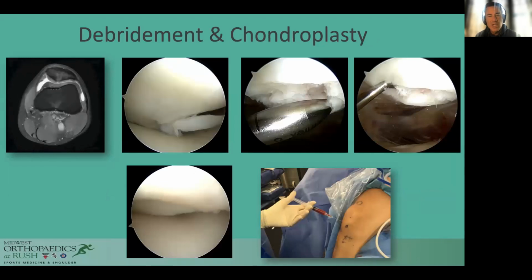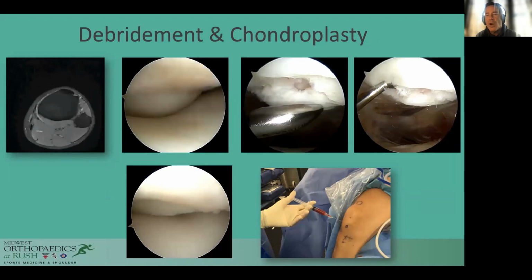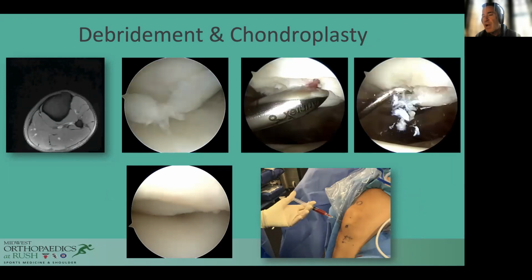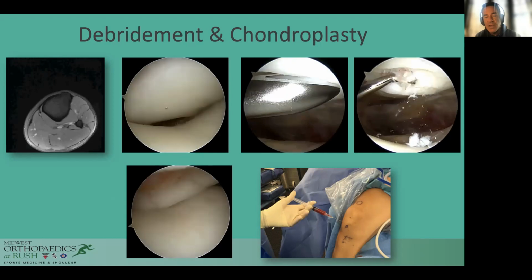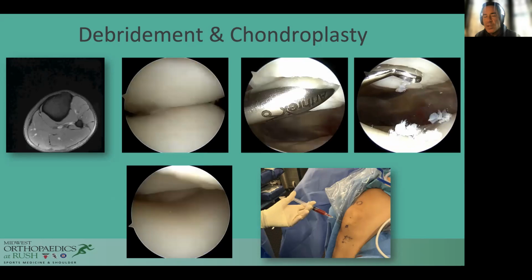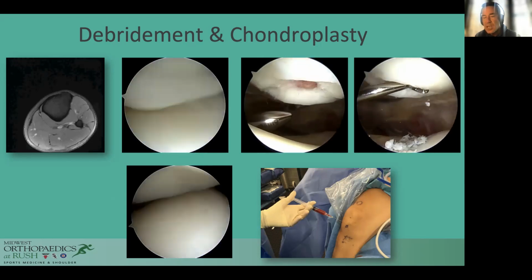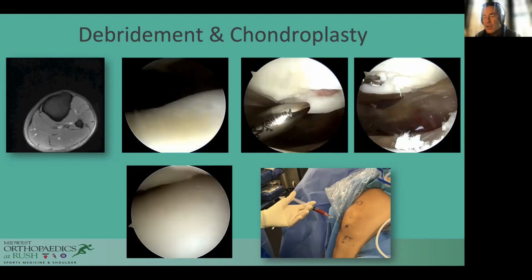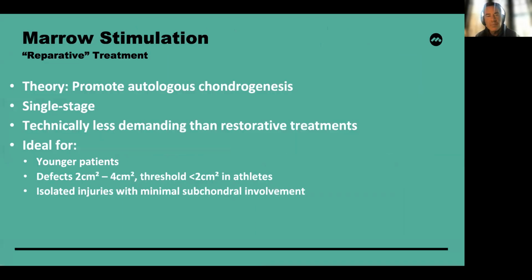Debridement and chondroplasty, as seen in this example here with a patella defect, which has unstable edges, can easily be treated arthroscopically, undergo some form of, say, marrow stimulation by violating the calcified layer, which may lead to some longer-term benefit. But the initial benefit can often be achieved simply by debriding the defect itself, getting rid of the mechanical element of it, and also minimizing the biologic debris that's present at the time of surgery. In addition, augmenting it with some type of growth factor therapy, such as the use of platelet-rich plasma, bone marrow aspirate, or other, might prove to be beneficial.